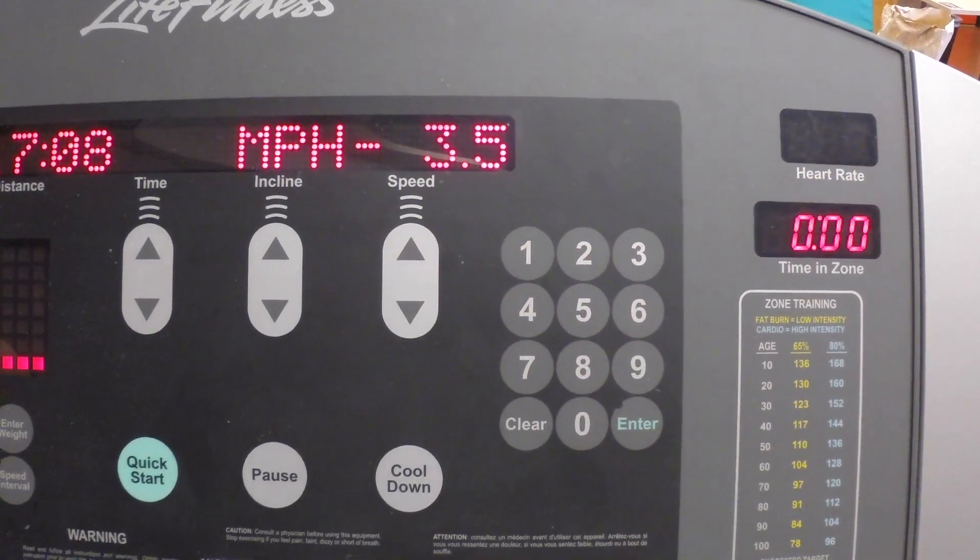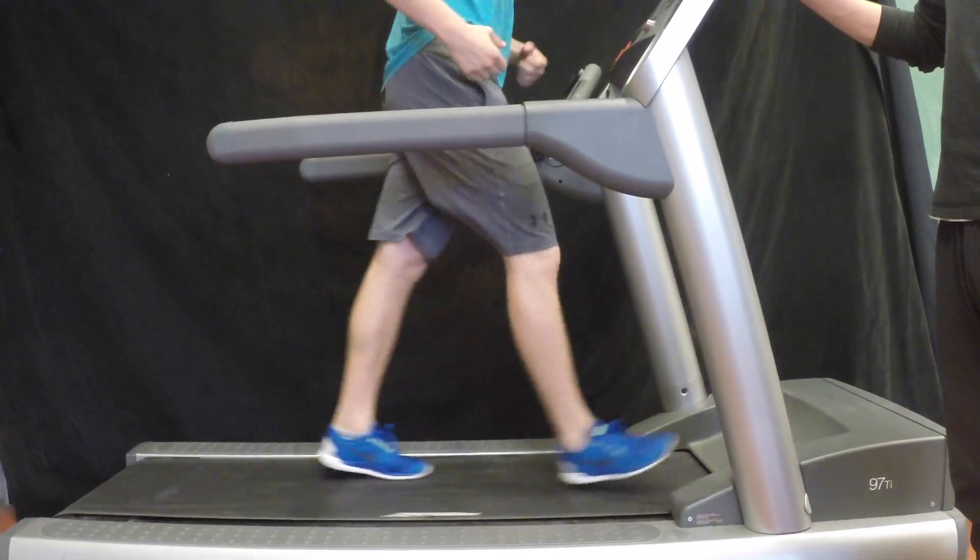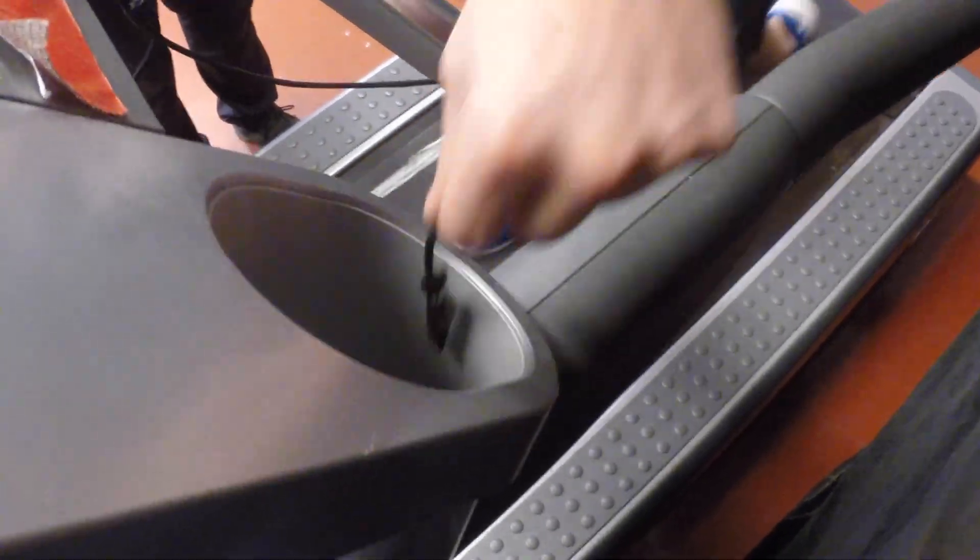In this case, we use 3.5 miles per hour. Now don't forget to have your client attach the safety clip.